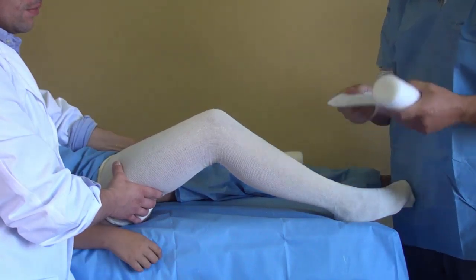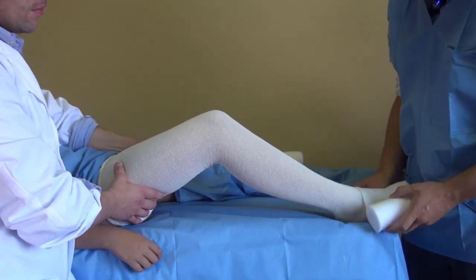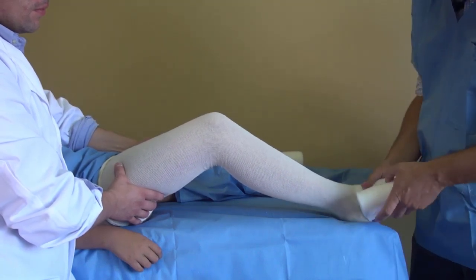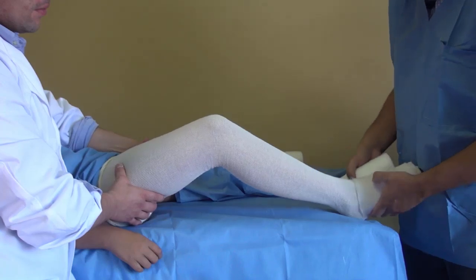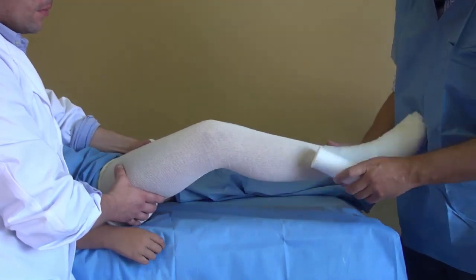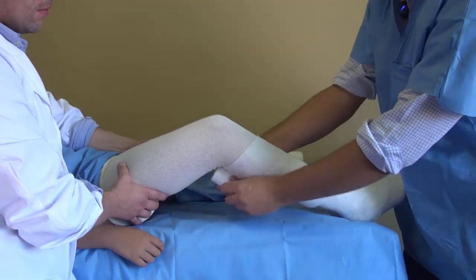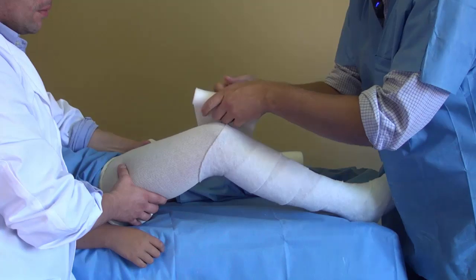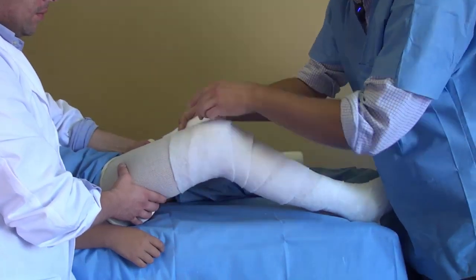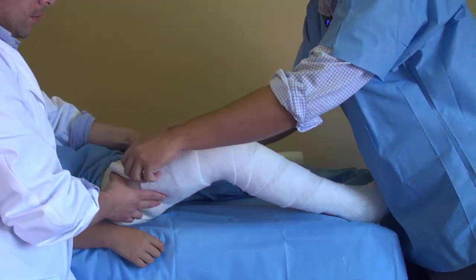Now we're going to take our soft padding and do the same thing. Just wrap it around, making sure that all the bony eminences — ankle, the malleolus, leg, the tibia, here around the knee, the patella, the condylar eminences — they're all covered and we won't do any harm to the soft parts.